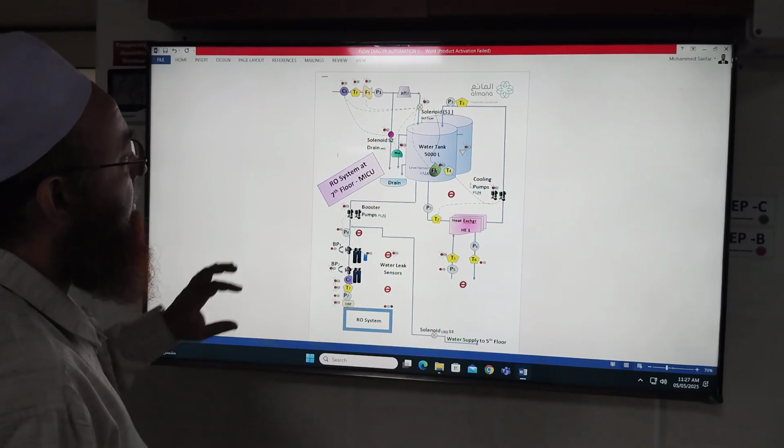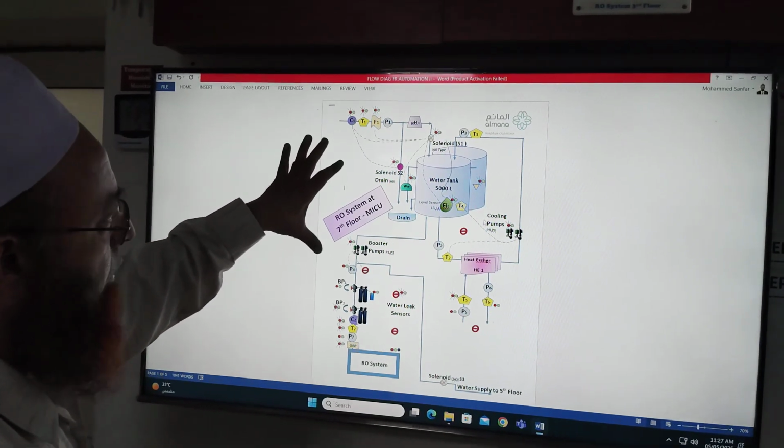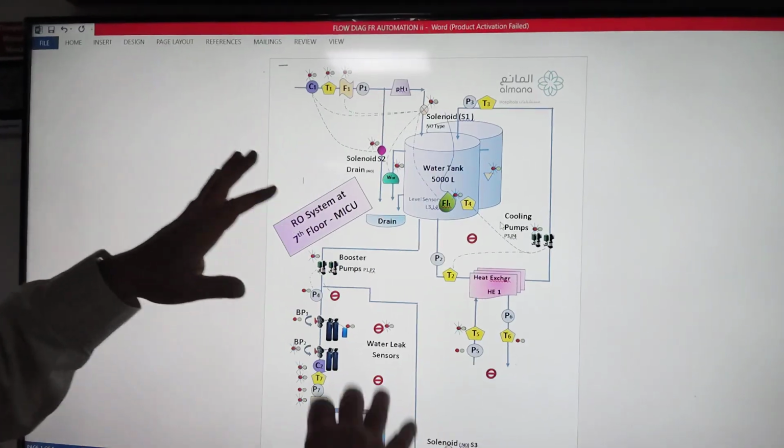Rahim. Here we have a water system which we want to make automated, to get all the messages on our screen.